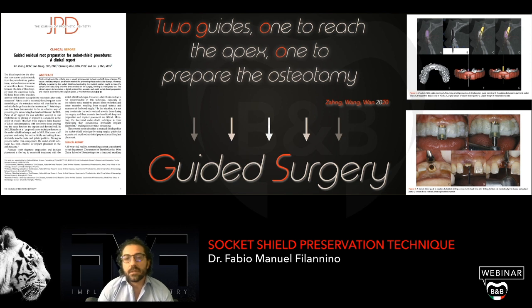So the first surgical guide is used to do the most difficult step of the surgery, that is to reach the apex in a conservative way and then work around the periapical area of the implant. And the second surgical guide is used to insert the implant in the perfect three-dimensional position.